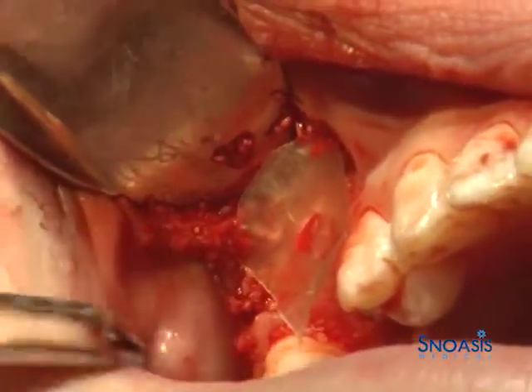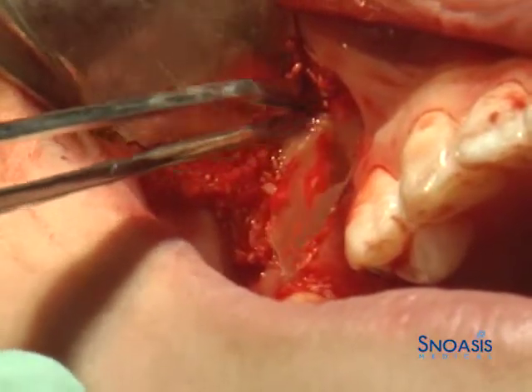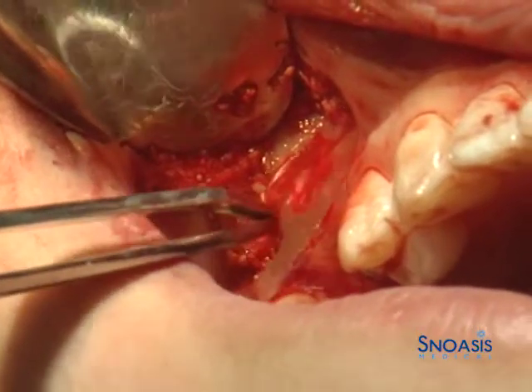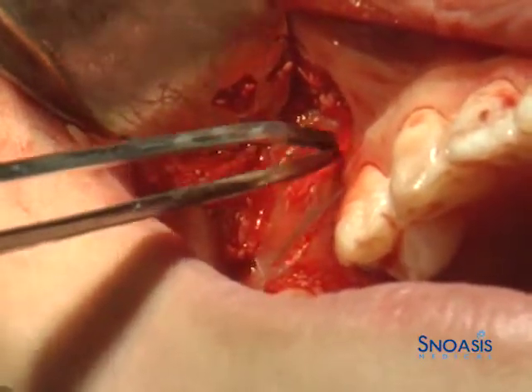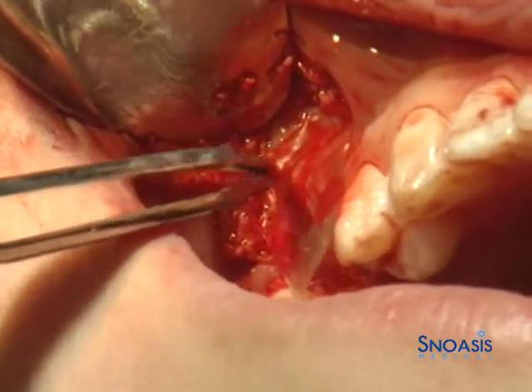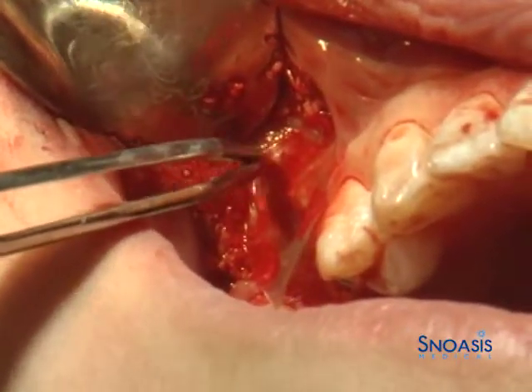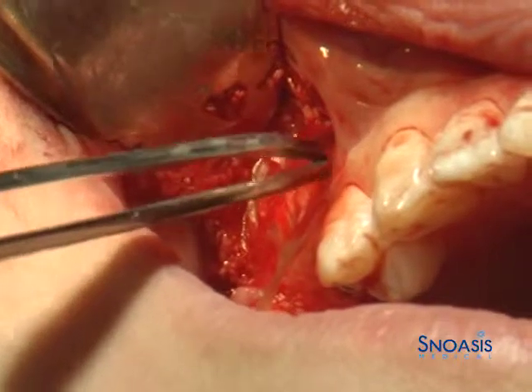Current protocols allow for minimal to no trimming of the membrane as it can be folded upon itself. This image reveals contact with blood in the surgical field and initial hydration of the membrane, which allows for it to stabilize and stay in place without any need for suturing. It is easy to manipulate the membrane to cover any grafted area and simply tuck the membrane within, and even fold if need be, in the surgical field.